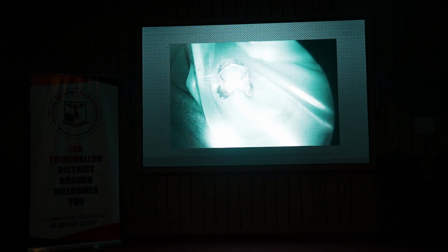And you can see there are also instances where we could not see where the instrument has just jumped out. Sometimes it just gets sucked out with the suction apparatus. So you can never do instrument retrieval without rubber dam.